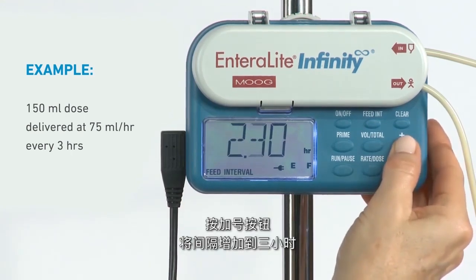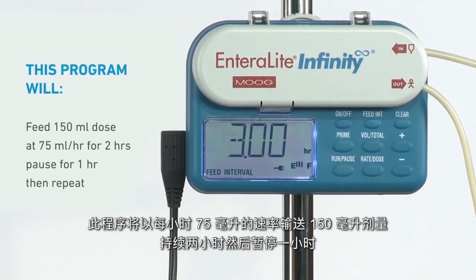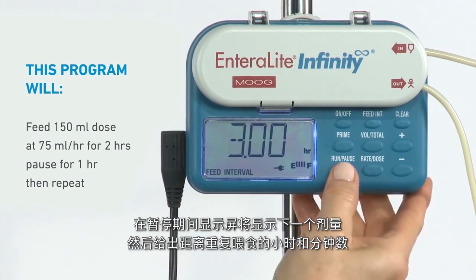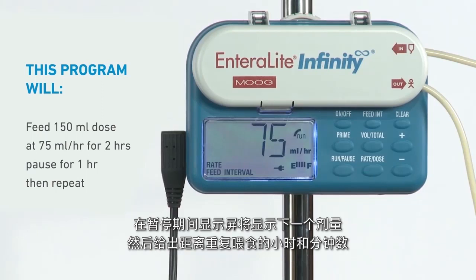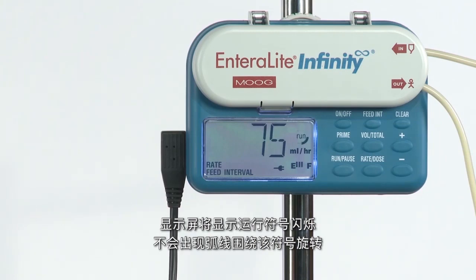Press the plus button to increase the interval to 3 hours. This program will feed the 150 milliliter dose at 75 milliliters per hour for 2 hours and then pause for 1 hour. During the pause, the display will read next dose, then give the number of hours and minutes until the feeding will be repeated.